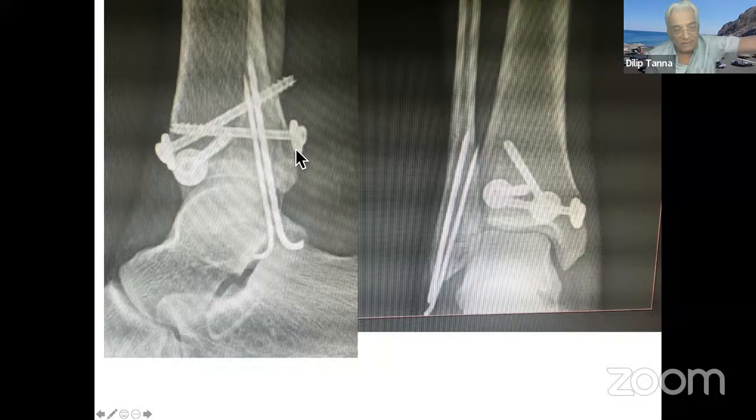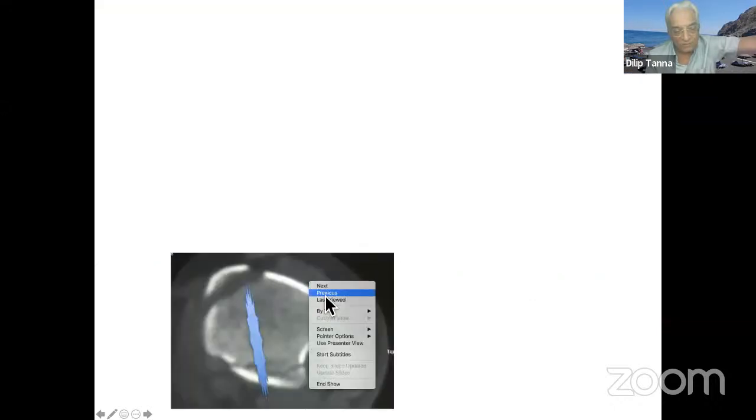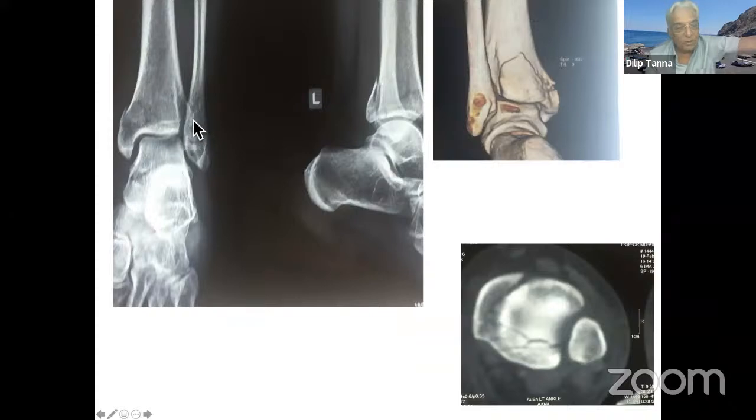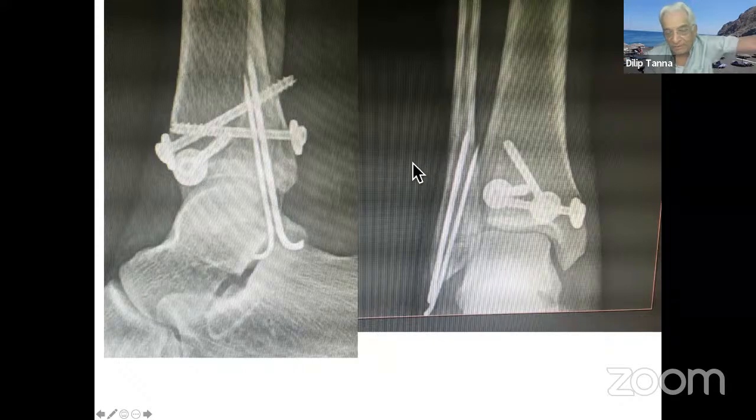Just 2-3 screws there. These are the lag screws. And the fibula was a small fracture, so I didn't bother about the fibula. I put only the wires there, as you can see. I put in these 3 screws and the wire in the fibula. And this is what ultimately I got, a full anatomical perfect reduction. So exactly as Asim mentioned, if you have that and you cannot reduce the other fracture, take out the hardware and reduce both of them simultaneously. Once you reduce them simultaneously, you will be able to get perfect reduction all over 360 degrees.